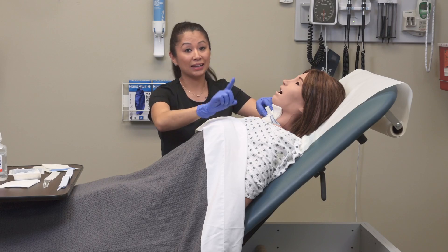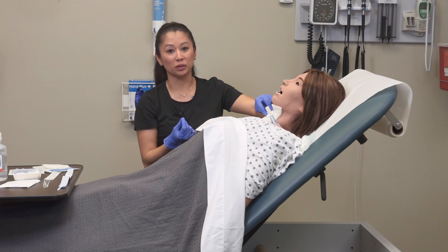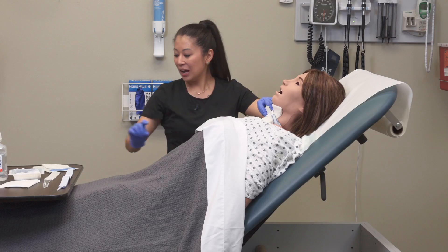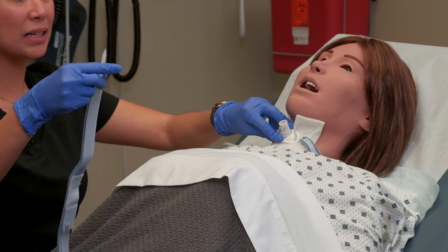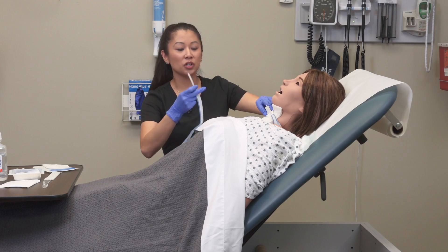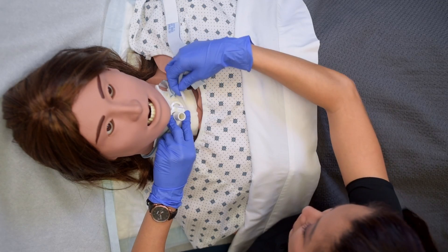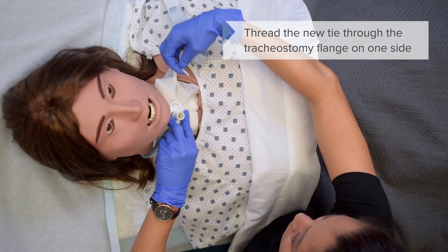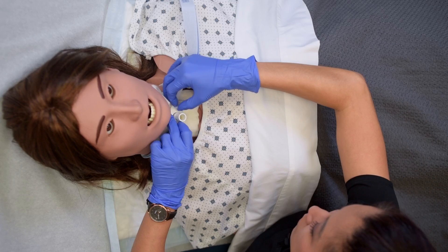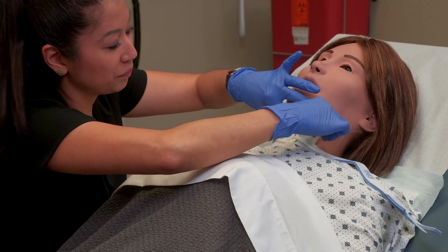If you had a colleague, you could remove one side, then the other, have the colleague hold the trach in place, then put on the new holder. Here's a tip for working solo to make sure this doesn't dislodge. I've loosened this up and I'm grabbing my new holder. Sometimes these trach holders can get really soiled, but this one looks pretty clean. I'm going to feed the new one through the flange while the old one is still in place, just to keep everything stable. Sometimes this takes a little finagling because there's a lot to handle while trying to keep the trach in place.